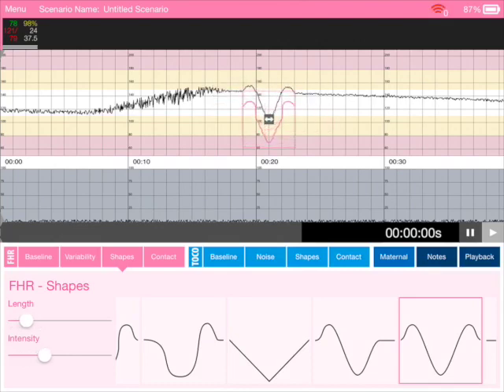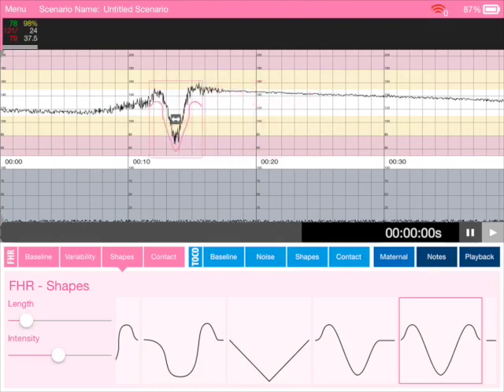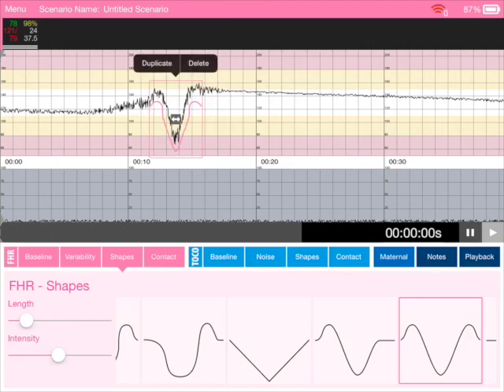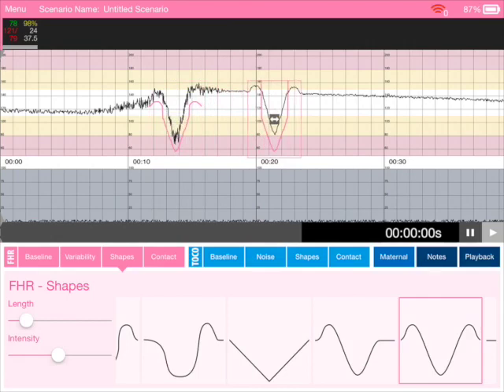Increase the intensity of that decel and we can move it around and move it into that sort of variable phase there. We can tap on it, duplicate it. We can have one exactly the same now and we can move that around as well.